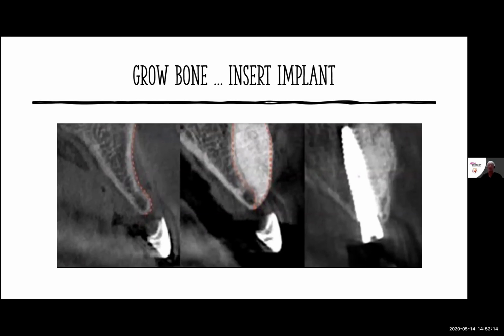And so in placing this implant, we're placing this implant right here at this junction point. If this was a block graft, at any point it could detach and come loose, and this implant just now became a wedge that's in there. But it does not do that because we've got blood supply that's coming in from the medullary bone from the top all the way to the tip of the apex of where our bone graft is coming.